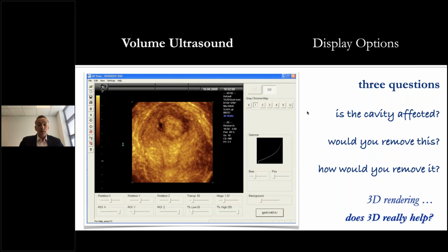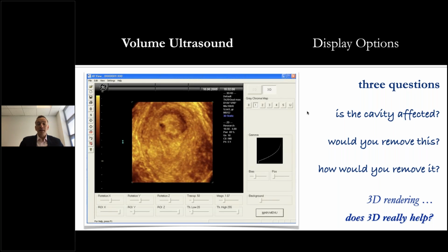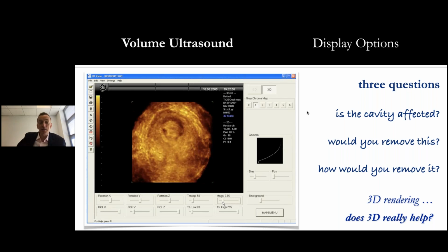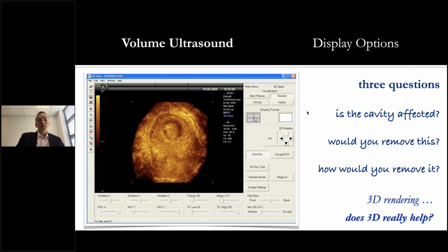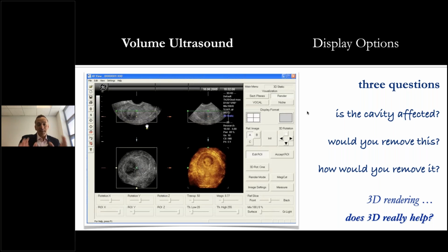And you can see potentially now, and maybe you're not all football fans, but you probably are in Singapore. I think that football's big, like Formula One. But you can make out the Jules Rimet trophy there, that gold picture with the football in the hand.